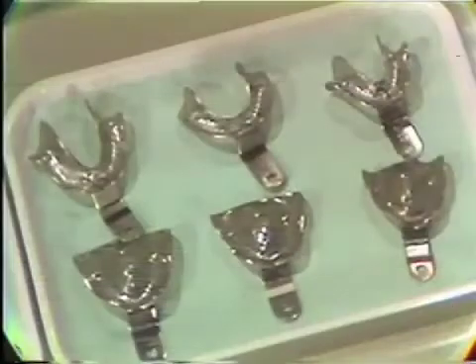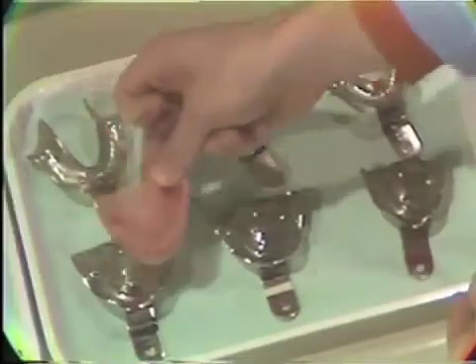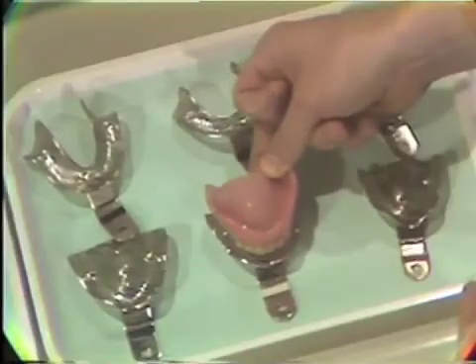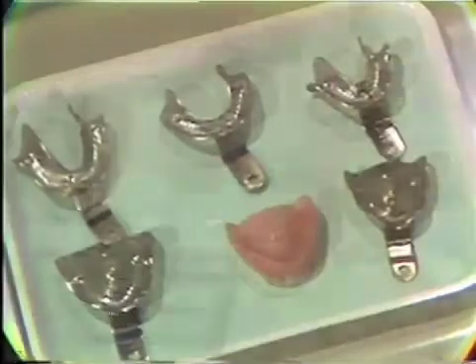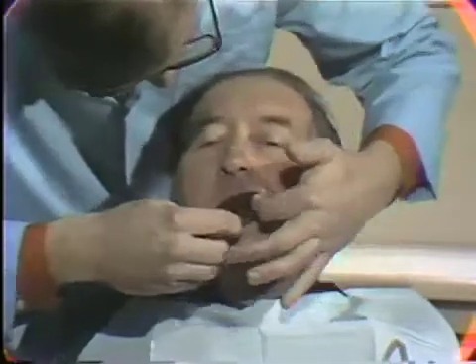The patient's present denture is a useful guide for selecting the proper size of tray to be used. The purpose of this tray is to carry, confine, and control the impression material, and therefore should be slightly oversized. The tray selected is always tried in the mouth to ensure adequate clearance on the peripheries and to determine where modifications may be needed in red utility wax.